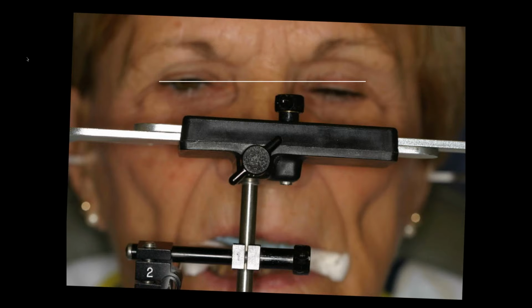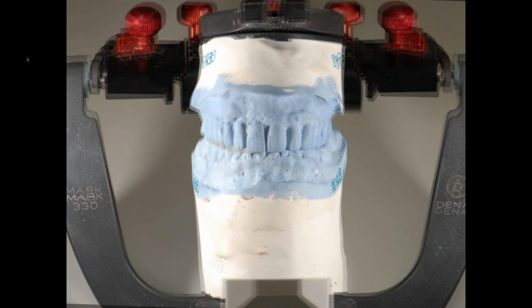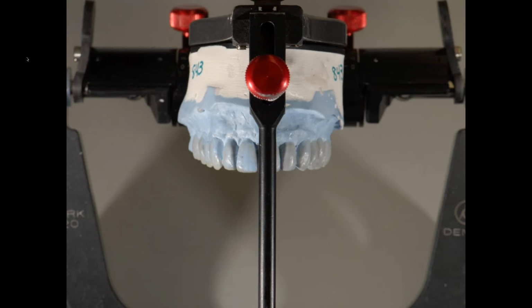And if I adjust this based on the horizontal axis, you can see how off it really is. The face bow needs to go back the other way a lot, in order to be correct for the horizontal. So what we perceived on the face on the articulator was wrong. The whole thing needed to go that way. Now once it does that, suddenly that left side doesn't look long anymore. And now we realize that the right side is too long on this case.